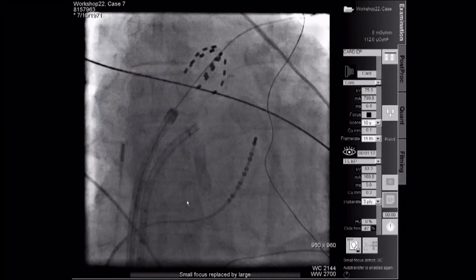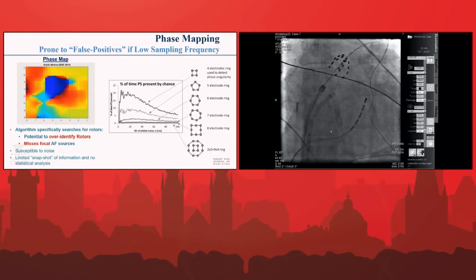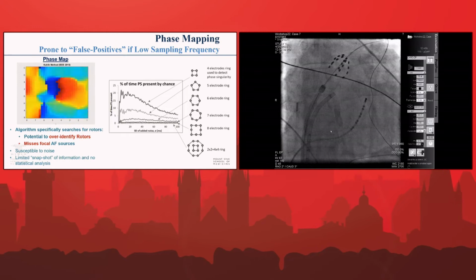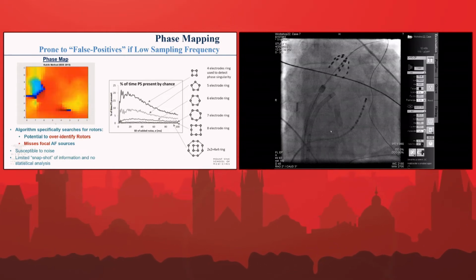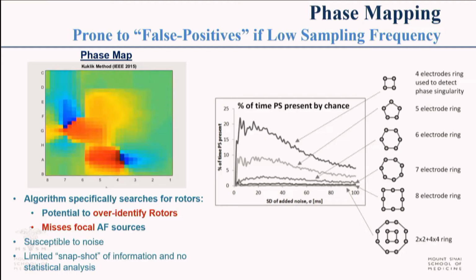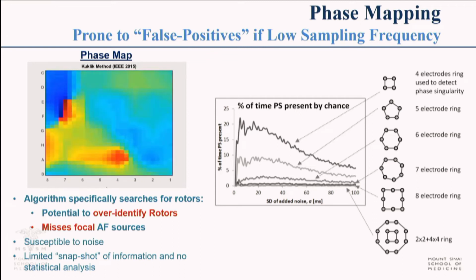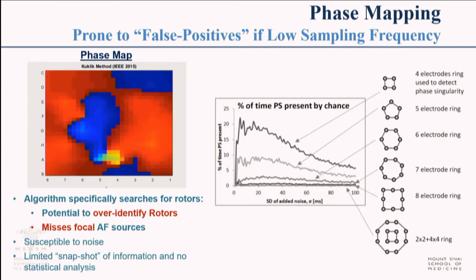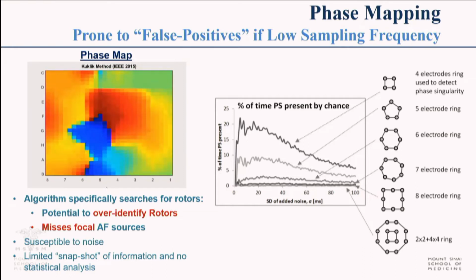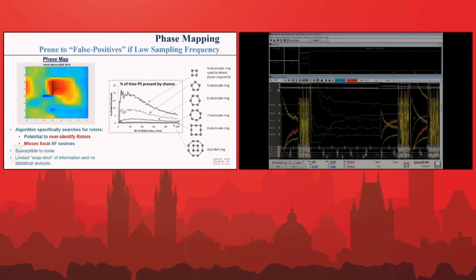Okay, so I'm just going to go through a few slides here. Before we start with what is EGF mapping, let's talk about where we came from in terms of phase mapping. As you know, we've had a couple of systems with phase mapping. One of the issues with phase mapping is that the algorithm is specifically looking for rotors. And this is a problem because there's the problem of false positives if there's low sampling frequency.